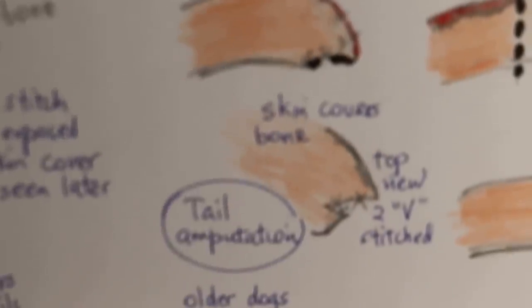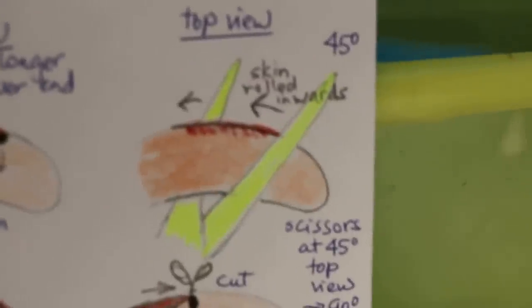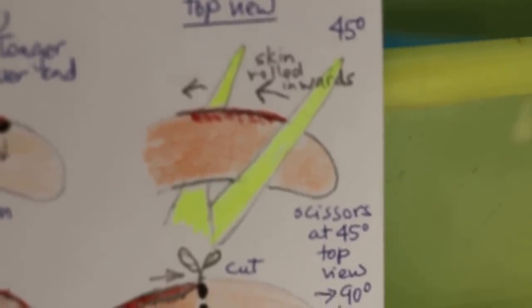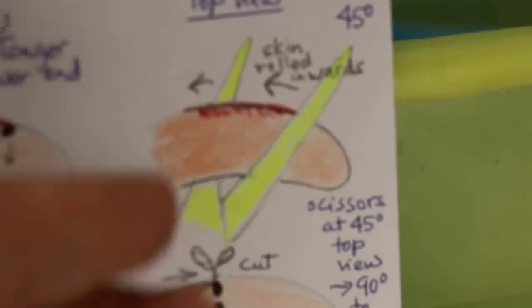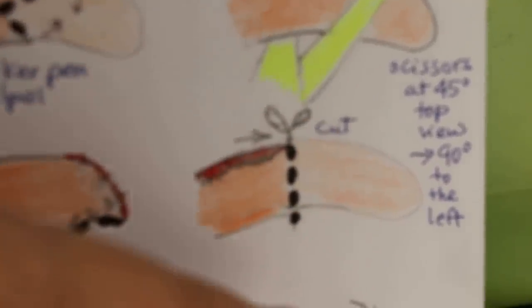And then you have a nice stitch covering the tail. The third method is to use forceps or scissors to turn the top part of the skin towards the anus, so you have extra skin there. When you cut, this extra skin will go forward and you can stitch it down below.